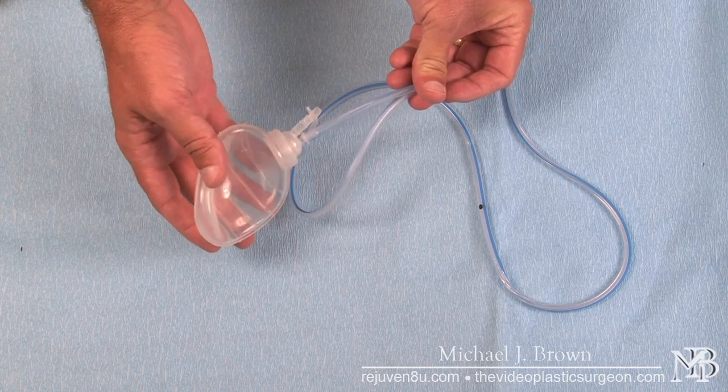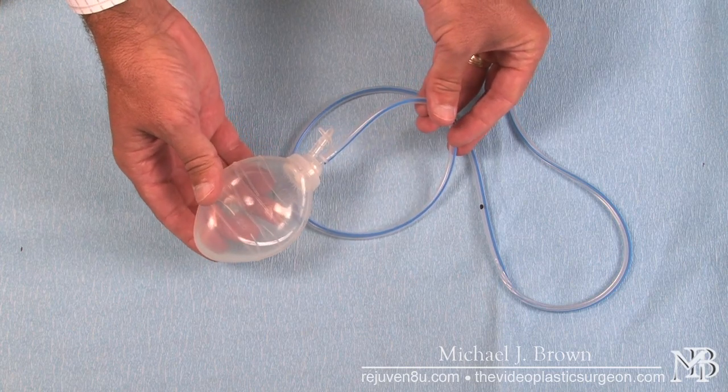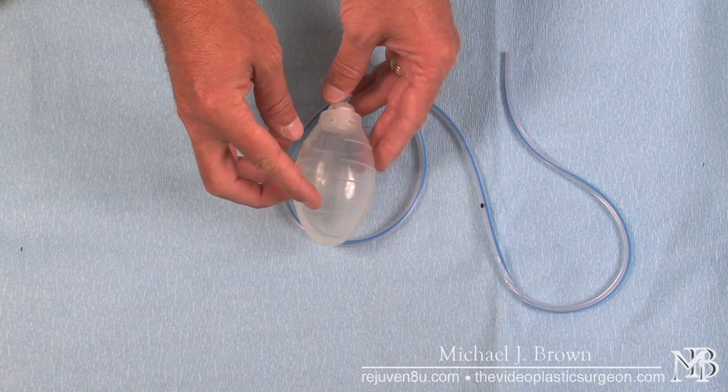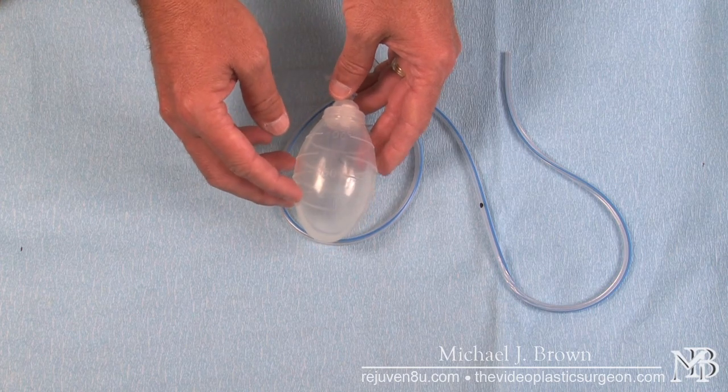I'm going to let it expand now so you can see what happens — it won't expand quickly, it will do it very slowly. You'll notice this drain has numbers on it which show the reservoir volumes, indicating how much fluid is actually coming out of the wound.